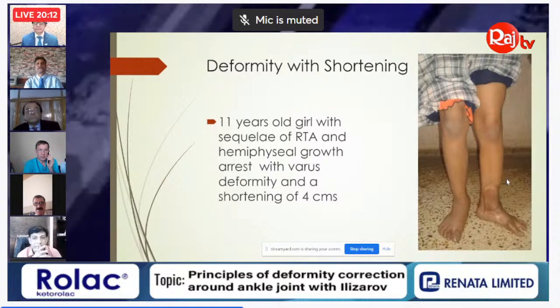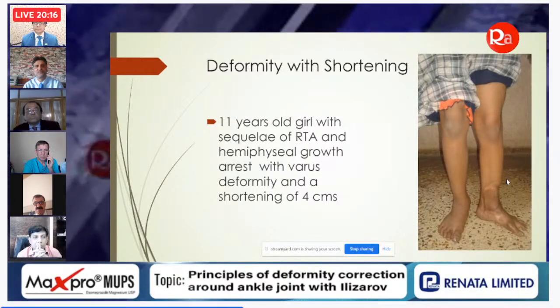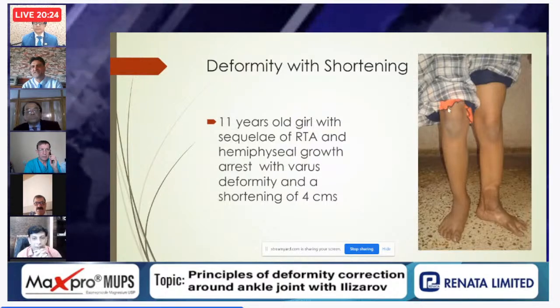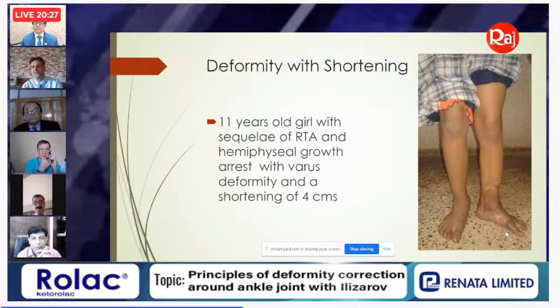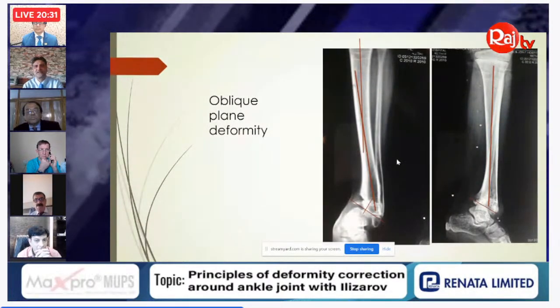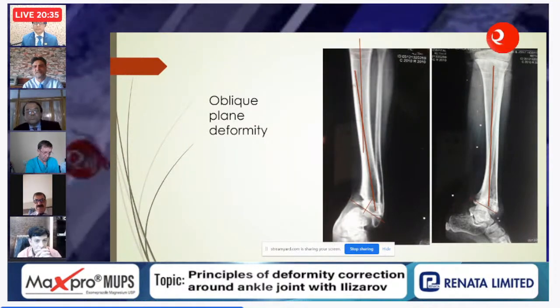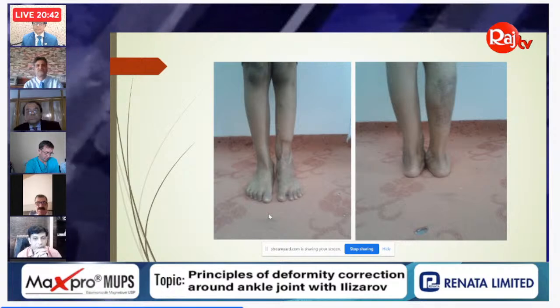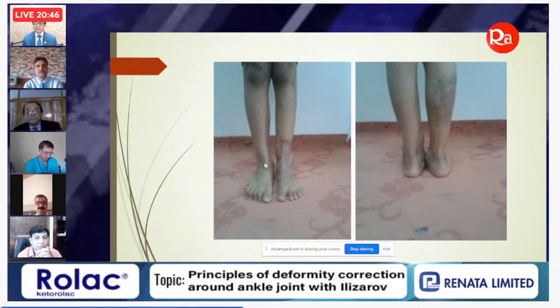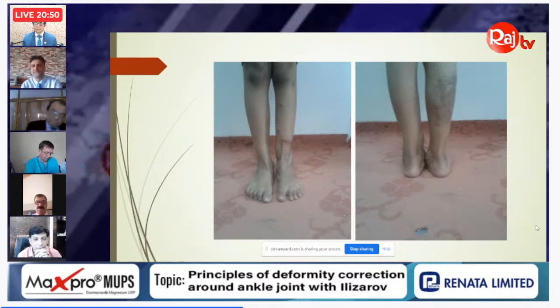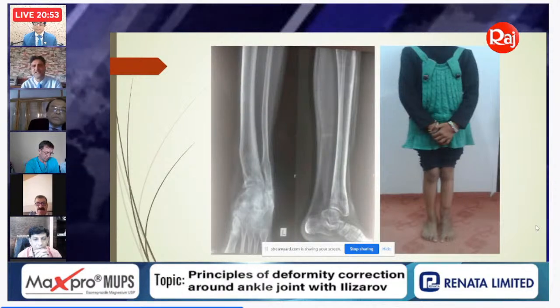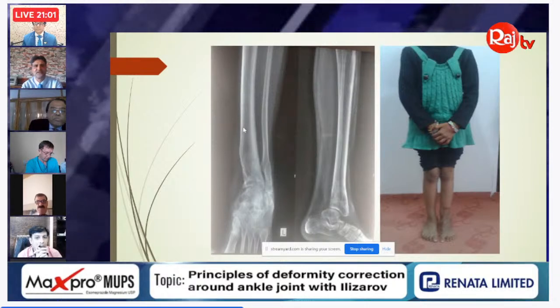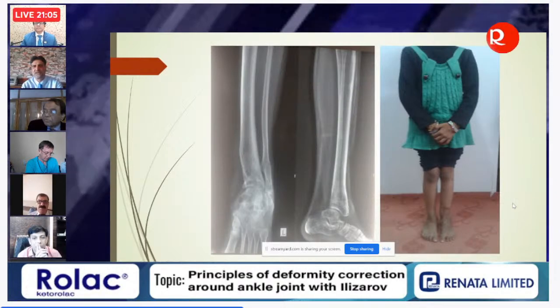A complex case: an 11-year-old girl with a road traffic accident had hemiphyseal growth arrest with varus deformity, 4 cm shortening, and external rotation deformity. The deformity had two centers of rotation of angulation (CORAs) with some angulation at one level and procurvatum in an oblique plane — a multi-planar deformity. After Ilizarov correction, the limb was restored to near normal, though some residual valgus and procurvatum remained for planned second-stage correction.